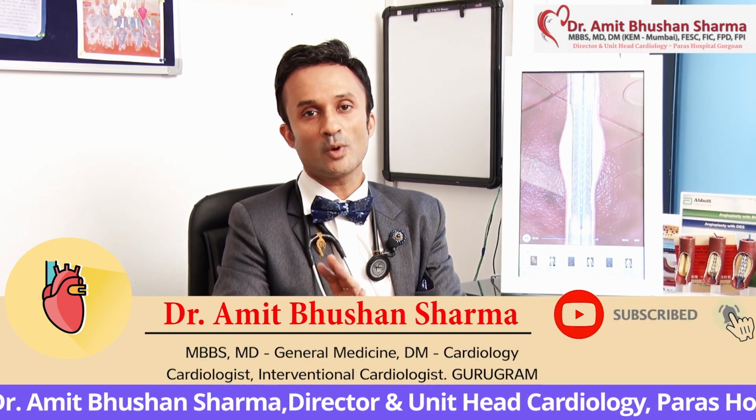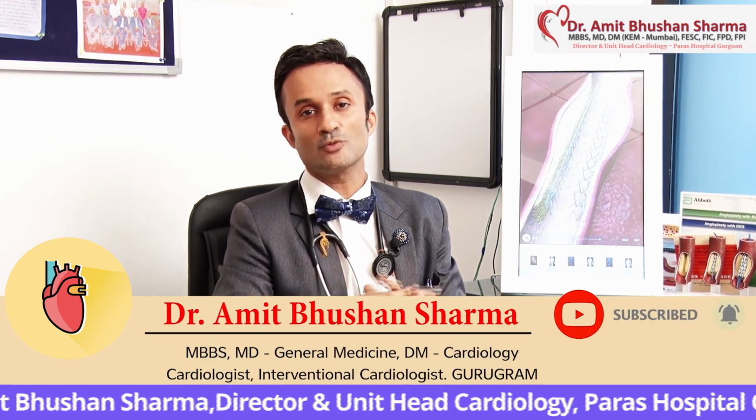So whenever you are asking for it, you ask for a mini angiography, especially in the elderly age group or people with any risk factor.